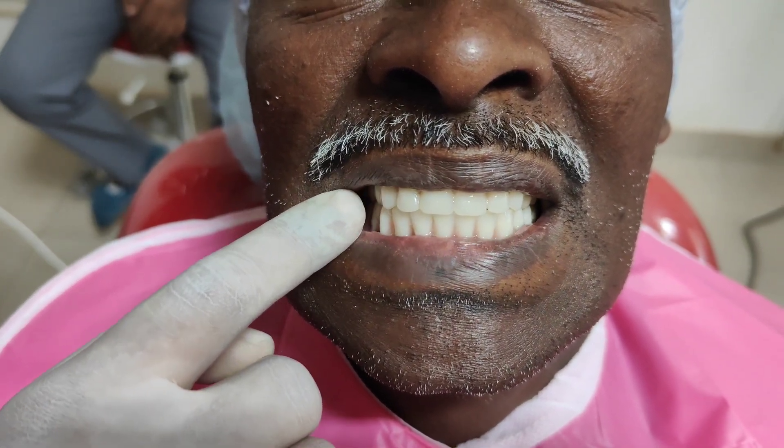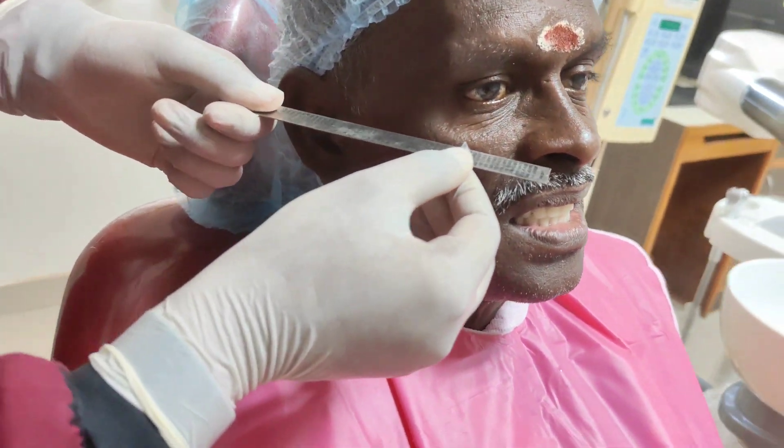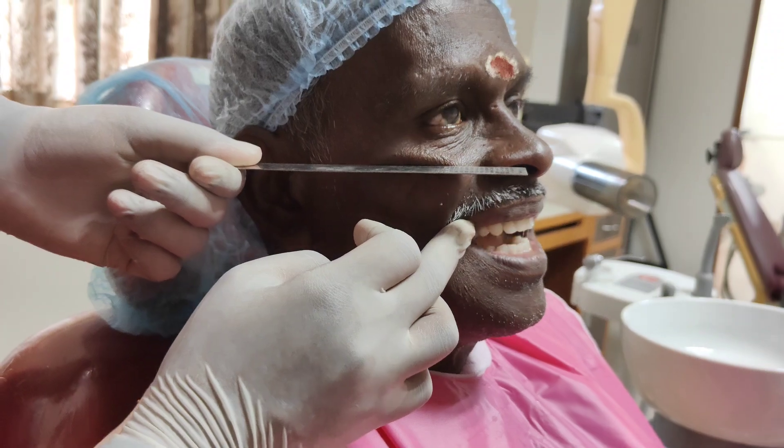The buccal corridor space — the triangular space on either side from the buccal surface of the premolar to the commissure of the lip — should be about 3 to 4 mm ideally, and has major importance in the aesthetics of the denture. The occlusal plane of the anterior and posterior teeth must also be checked: anteriorly it must be parallel to the interpupillary line, and posteriorly it should be parallel to the ala-tragus line.